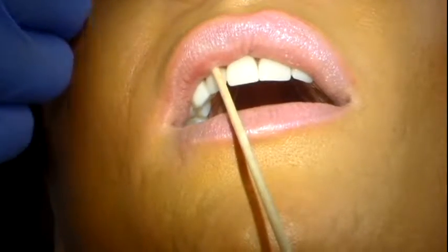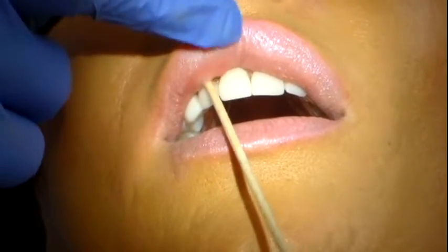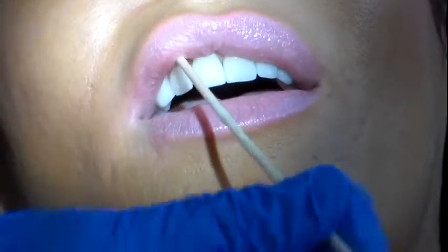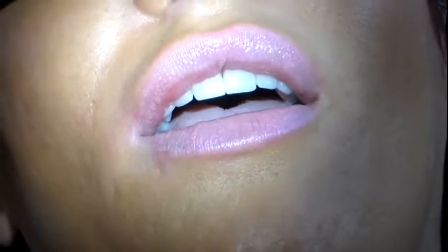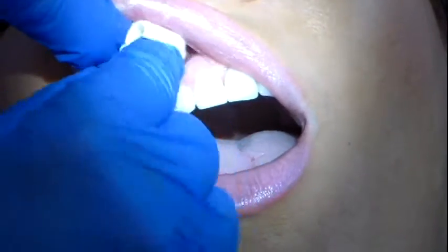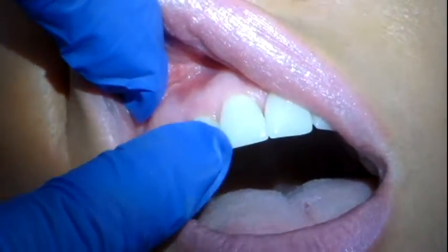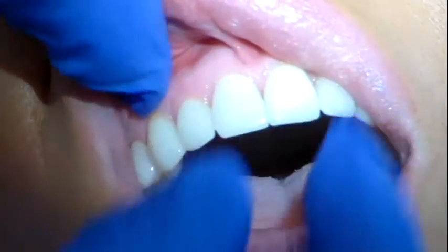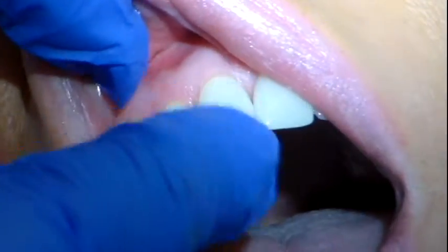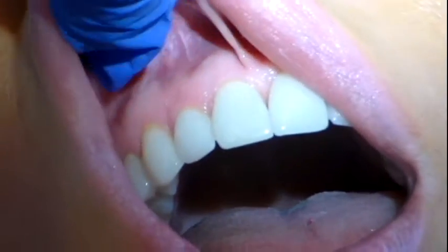It can go all the way up into the nose area and the labial mucosa on that side. We're going to remove the topical and wipe the excess off. When you're working up here on these anterior teeth you have to be really careful because some people have a really tight frenum and if you're pulling really hard it can really hurt. If that's the case, get your finger way up in there and pull more from the inside of the cheek.